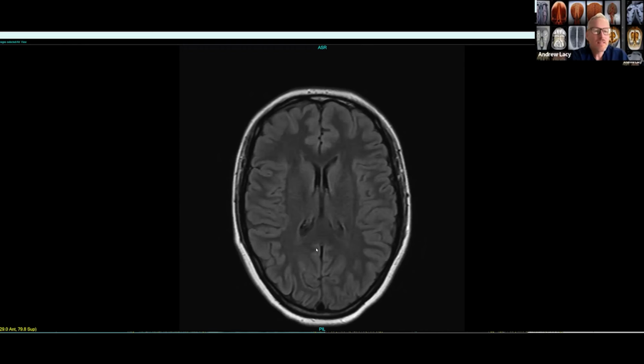There's a question. Let me tee this up for you, Sean. There was a question about false positives, false negatives, and so on. Here I'm going to presume that we're talking about cancer and sort of cancerous lesions. Your radiologists essentially risk stratify the lesions that they see, right? So we have a 5-point classification that we're working towards, and the first 2 points are essentially don't worry, they're benign. 4 and 5 is, hey, this is really concerning or increasingly concerning. We really need to go follow this up. And then there's a category in the middle that's indeterminate. Some of those are indeterminate because they're pretty small, and maybe we would follow them longitudinally. And some might be indeterminate because we need to do additional tests. Is that a fair summary?